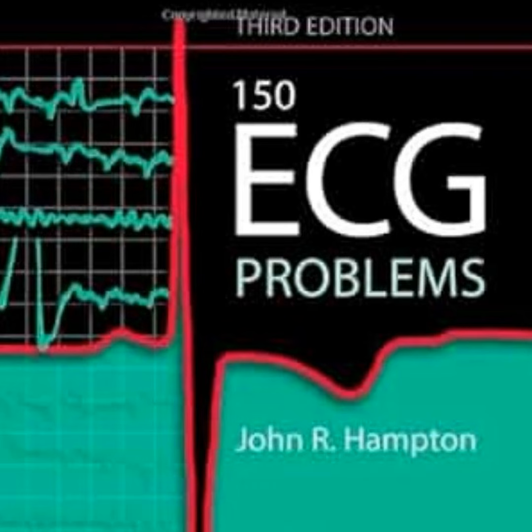And because this depolarization is moving in a totally abnormal direction, from right to left and often inferior to superior just to reach the lateral wall, the overall mean electrical vector is pulled sharply upward and leftward. And that upward and leftward pull is the left axis deviation on the ECG. Precisely. And that slow cell-to-cell spread through the myocardium is exactly what creates that wide, bizarre-looking QRS complex that you see on the paper. That is so cool to visualize.